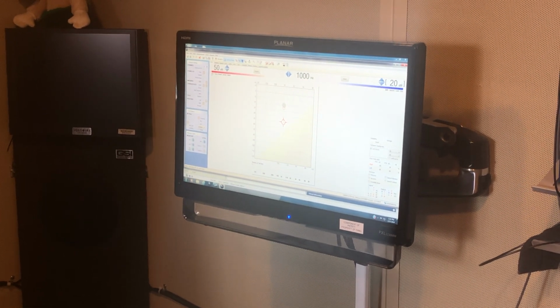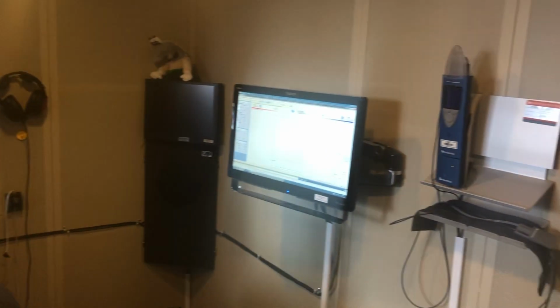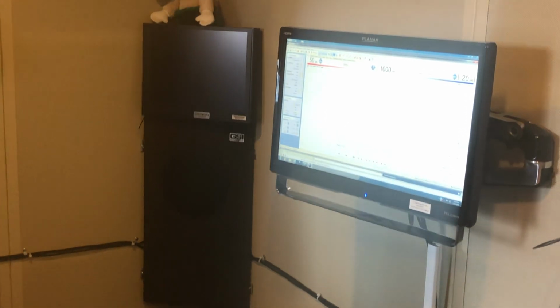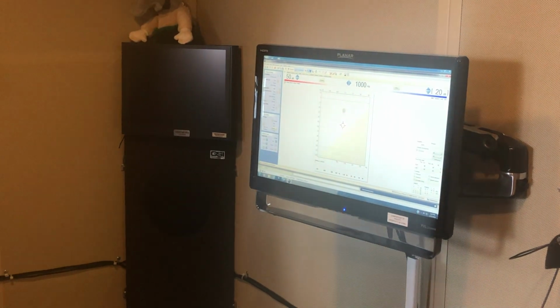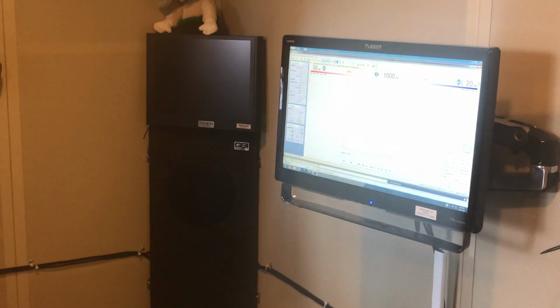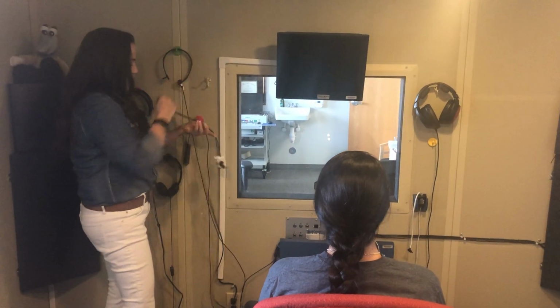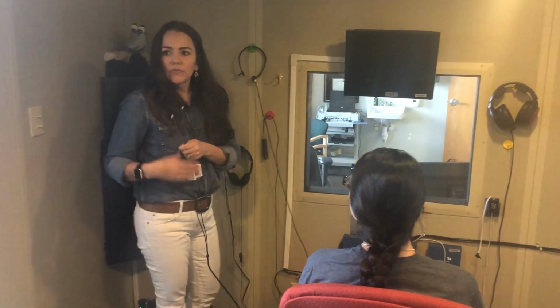We can try that today. My switch has been acting a little funny, so see, right now it's not showing up. Yeah, we're not going to use it. We're going to raise our hand. It's intermittent, and that gets really annoying because test results aren't as accurate, so we're not going to use the response switch. You're going to use insert earphones on your patient.